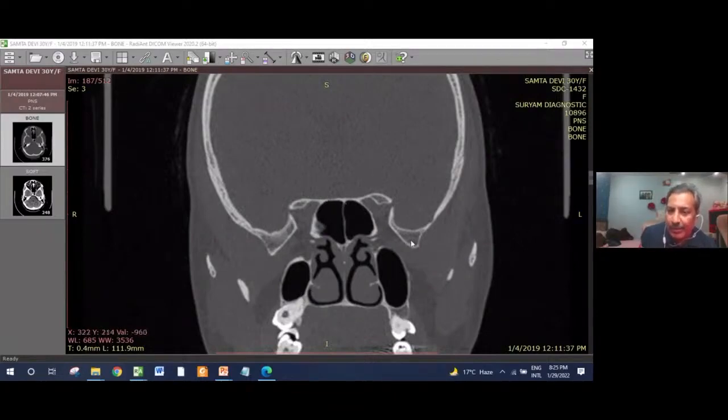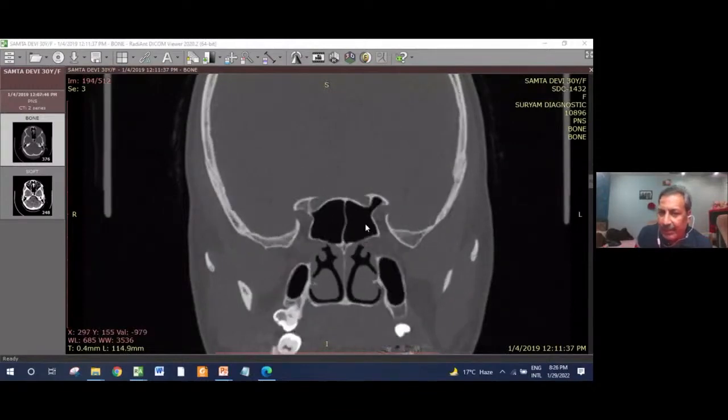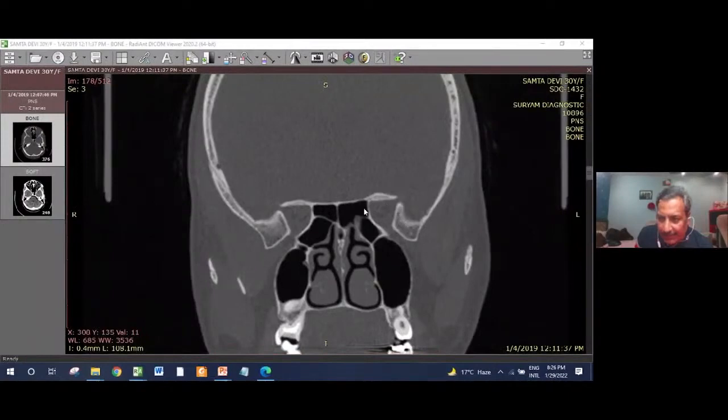I would say here that's the most important area for a surgeon to execute his work in a very, very careful manner. The reason being the critical structures are in close proximity now. As compared to the anterior one, the complications are more hazardous, more fatal, and you have to stay extra careful for that reason here. So in the sphenoid sinus, this is the intersinus septum. As I said, this is the roof of the sphenoid formed by the lesser wing of sphenoid.